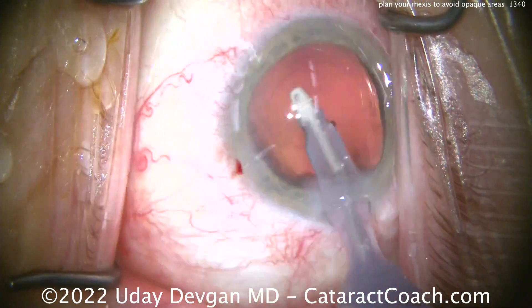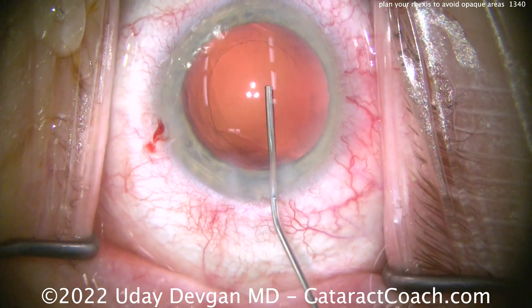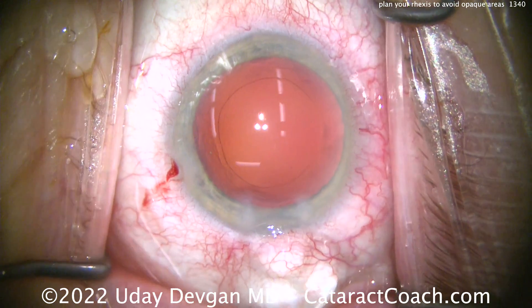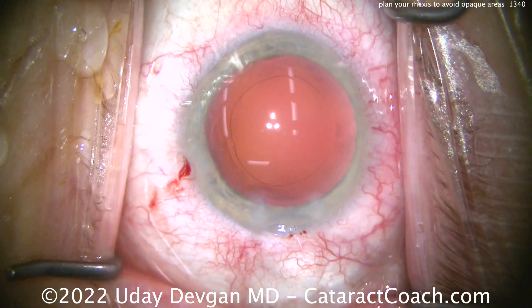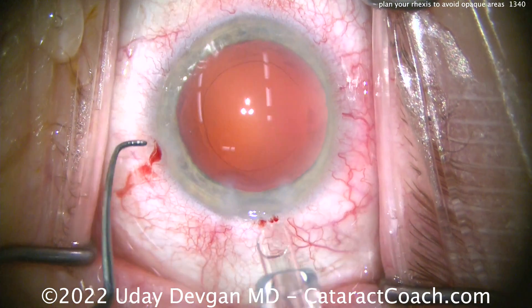Here's taking out the cataract. Here's polishing up the capsule bag — let's get to the end of the case. There's the rhexis; looks pretty reasonable. You can do this technique — it's not that hard. You've seen other videos here on Cataract Coach where I'll do a capsulorrhexis even under the iris a little bit.